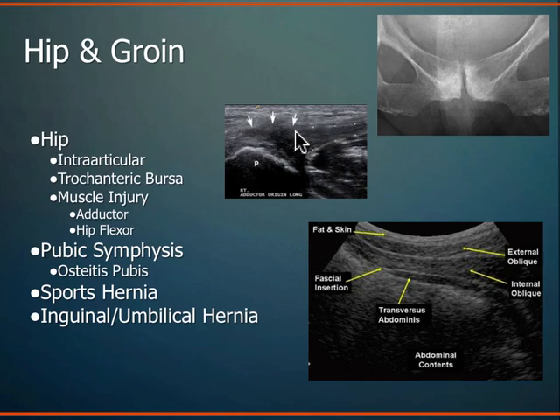The groin and the hip is an area where MRI is traditionally less reliable, and it's very hard to image some of these subtle muscle weaknesses or muscle fascial herniations. And there are things like sports hernia, which is a very nebulous topic where you could have pathology involving hernia structures or muscle tears or tendon tears, and a lot of different things can happen in sports hernia that traditionally are not imaged on MRI, but we see very well with ultrasound. And these are some of the muscle tissues that sometimes can be involved in sports hernia that you can see quite well with ultrasound.